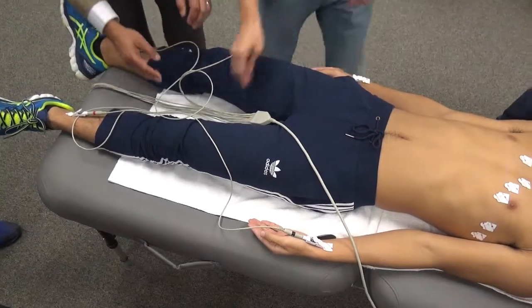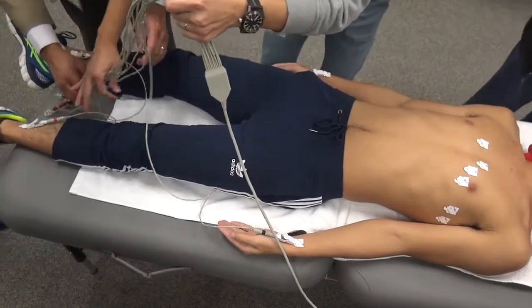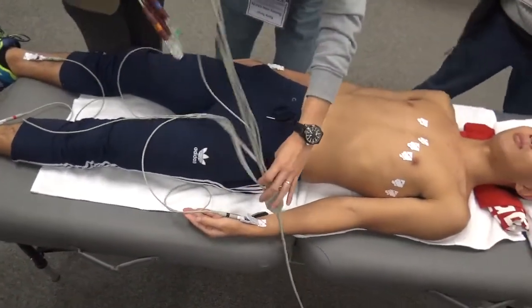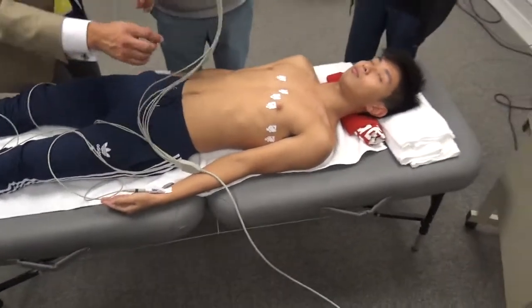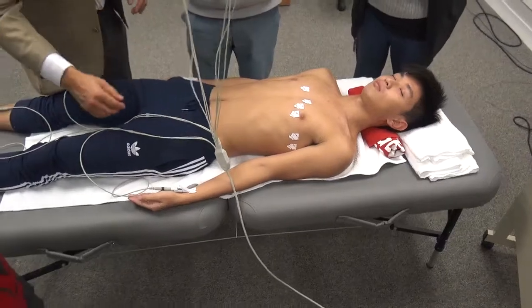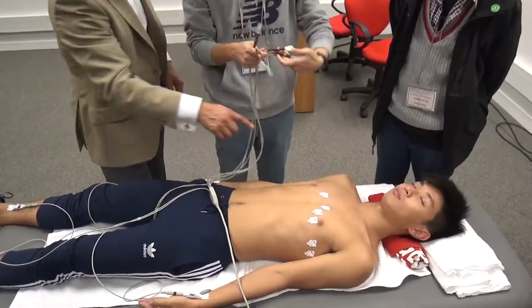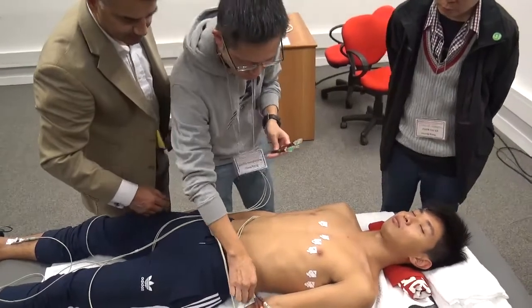That's good. Okay. Now you're going to pull these. Make sure these aren't getting in the way. That's it. That's fine. Make sure you pull it up. Okay. Now separate these two again. So these are in threes. Okay. V1 to V3. So there's two groups here. You see that? Two groups. See them? That's it. Yeah? Good. I tend to leave this on here, otherwise we'll pull. It's quite heavy, this, okay? So just align them, V1 to V3, 4 to 5, 6, that's it.